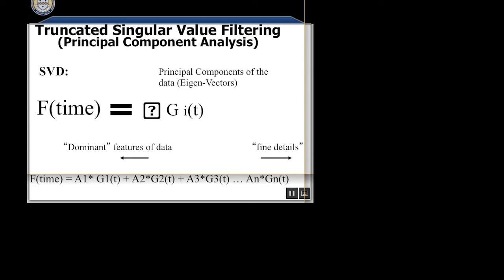Okay? So it seemed like a lot of people in this crowd did EEG. PCA or ICA, which is a very similar type of method, unless you're a mathematician, then you'll crucify me for saying that, are widely used in EEG for things like heartbeat removal and eye blink.